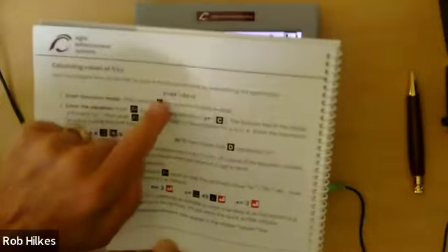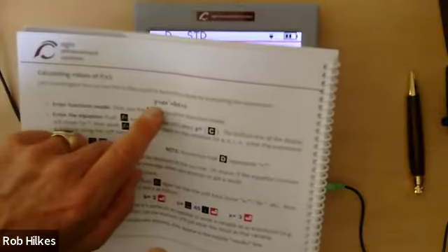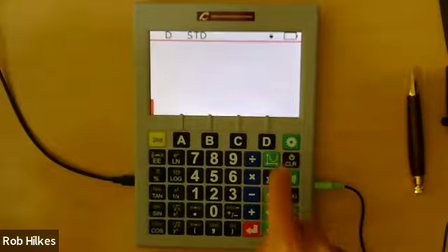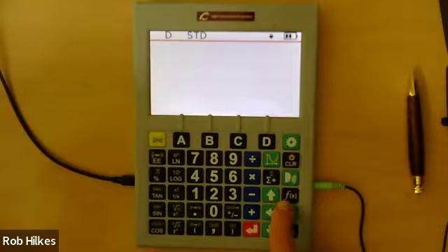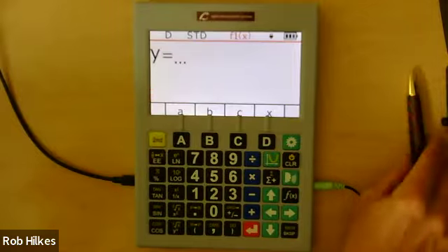In the manual, it talks about this function format that I talked about before. I mean, you can enter any format you want, but we will enter this one because it's a very common algebra format. The way I do that is by pressing this f of x key down here. f of x is a well-known mathematical symbol that says a function of x. So y is a function of x. And then I get this screen here.